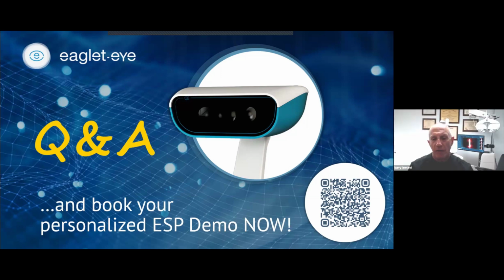So we started years ago, and you can certainly look at my web pages sometime to explain it more, but this sort of stepwise flow that we all follow is, first, getting vision and getting topographies. But once we brought in the Eaglet, we realized, where do we put that in? So in the beginning, we said, let's do everybody. But as we all know, it's not real time consuming, but it does take a little extra work. And I don't really want to do it if I'm not going to use it.